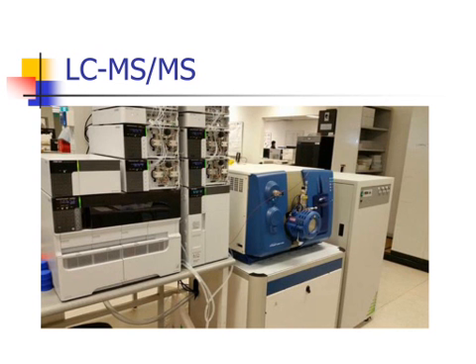So this is just a picture of one of the LCMS systems we have in our lab. The blue box there is the triple quad mass spectrometer, and then on your left there, that is a very large HPLC unit, because we have a large autosampler since we do quite a lot of samples, and we have 2 stacks of pumps because we generally do a lot of online solid phase extraction in our labs.